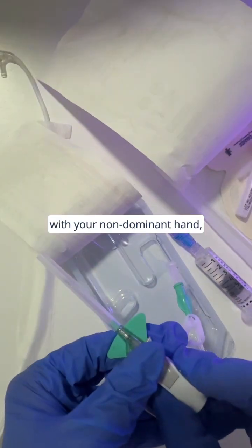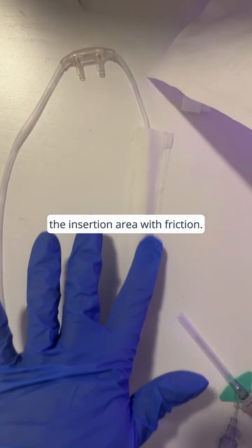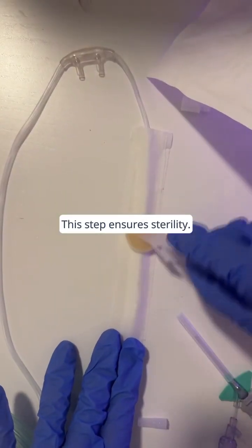Now, anchor the tubing with your non-dominant hand and clean the insertion area with friction. This step ensures sterility.